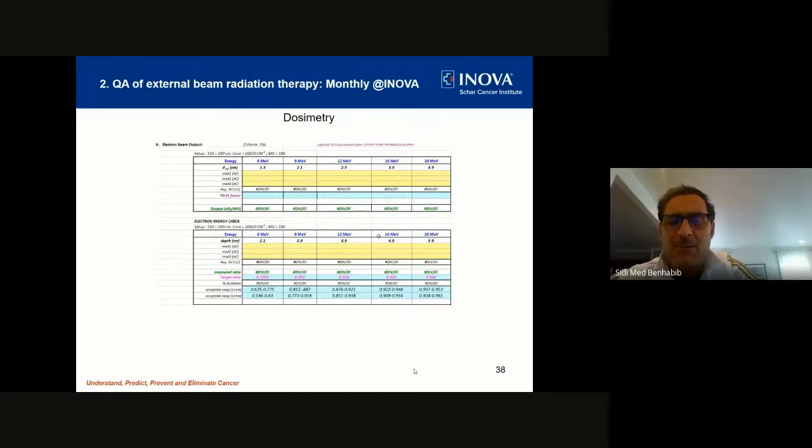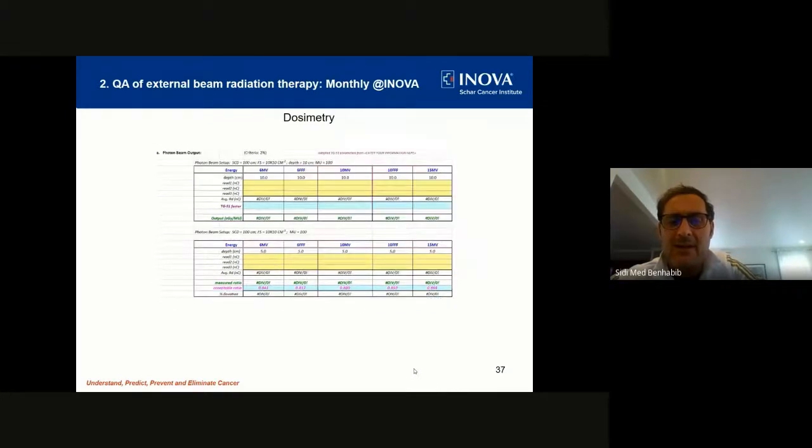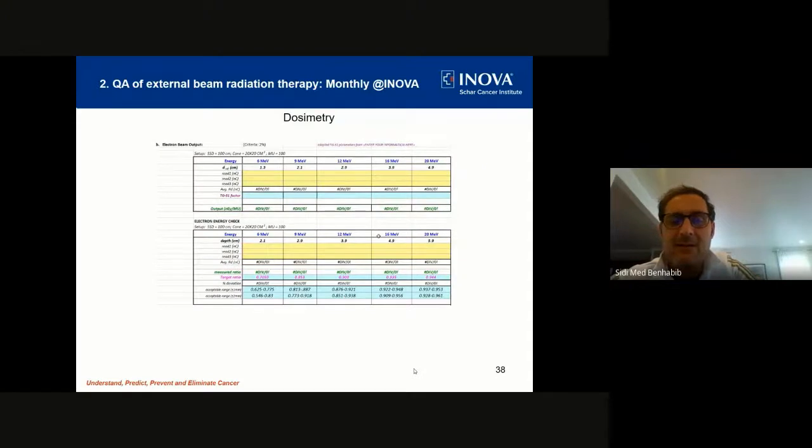This is for electrons. For the electrons, we have 6, 9, 12, 16 and 20. The same thing, we do output check and we do energy check. For the output check, we do the measurements at DREF, distance of reference. Next slide, please.